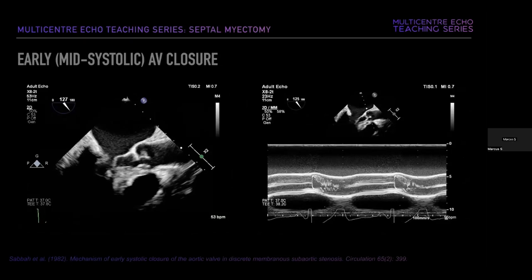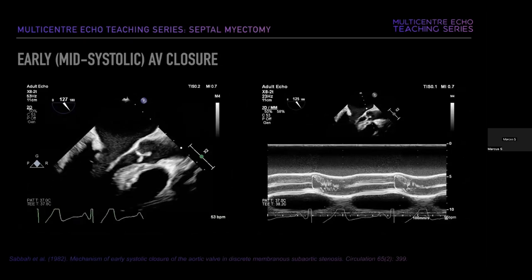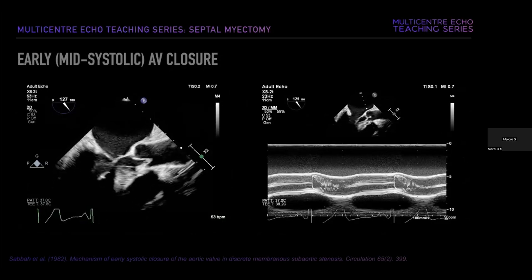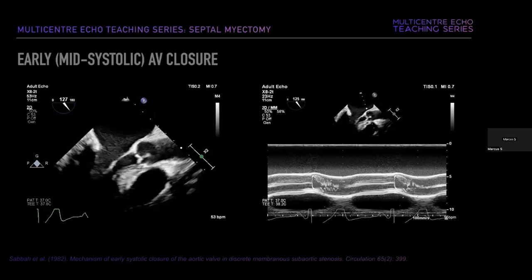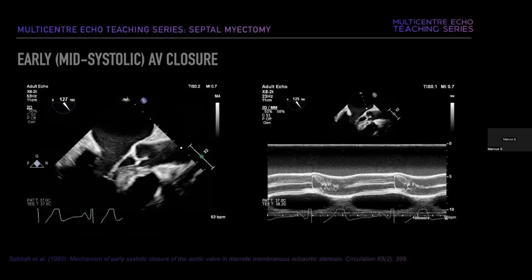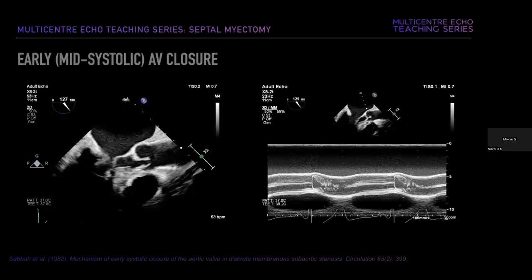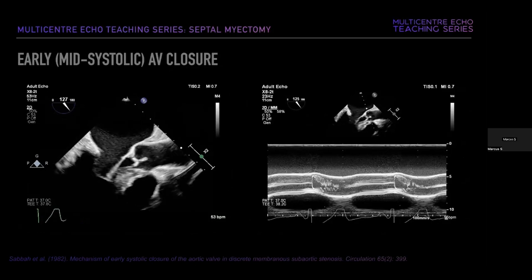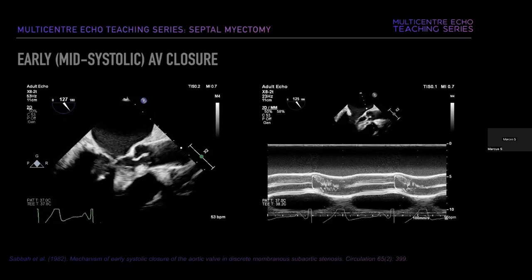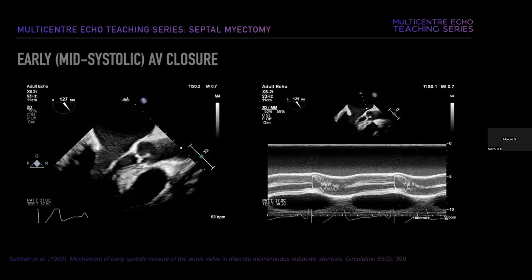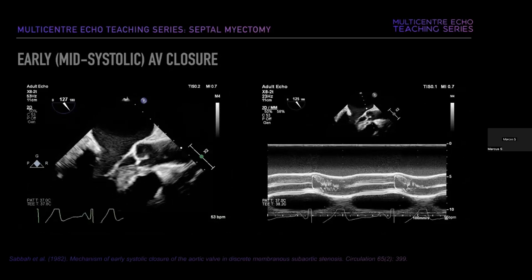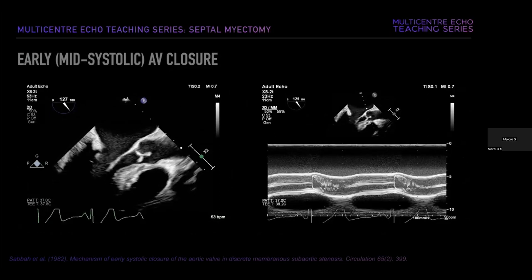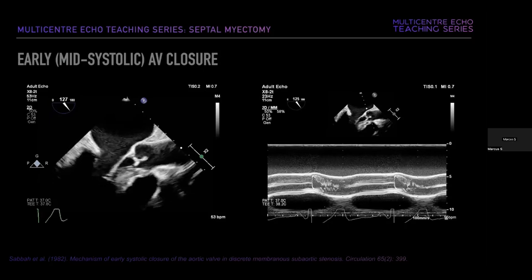The flow turbulence through the LVOT also causes fluttering or early systolic closure of the aortic valve during mid-systole. One dominant theory from Sabe et al. in 1982 suggests that turbulent flow increases kinetic energy of blood through the LVOT. Because total energy remains constant, this occurs at the expense of a pressure reduction in the LVOT proximal to the aortic valve, and the resultant pressure gradient leads to premature closure.